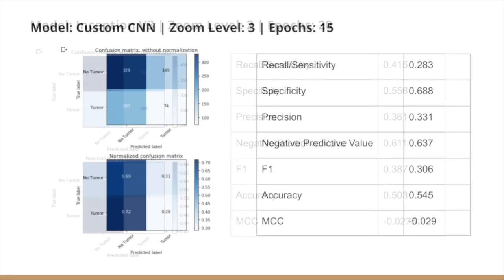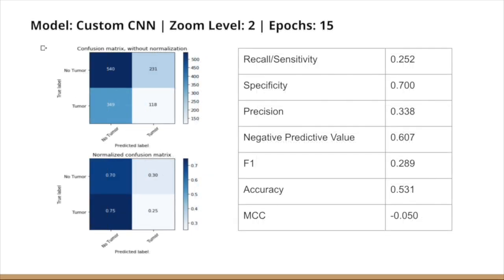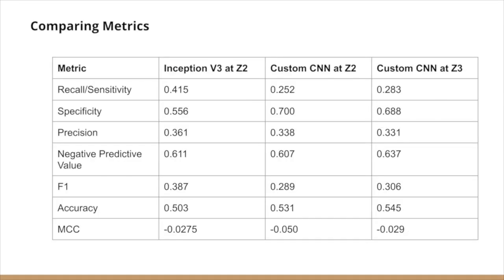Here are the results for the 3 models. The viewer can pause at a specific slide for details. I will compare the metrics for the 3 models side by side. These are the metrics for all our 3 models side by side. Even at first glance, we can tell our 3 models are highly inaccurate and should not be used in practice to classify patient information. Regardless, we will examine each metric in closer detail.